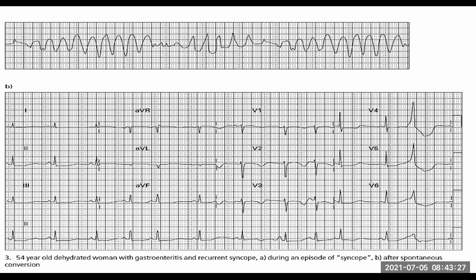So what is synchronized cardioversion? Synchronized cardioversion is where you try and match the electrical impulse to the peak of the R wave, all right? In other words, you're trying to stop the heart at its very maximal contraction. So at the moment that it's at its worst, it's tight, boom, you just stop it dead in the hope that when it restarts, it will restart normal. That's basically what synchronized cardioversion is.